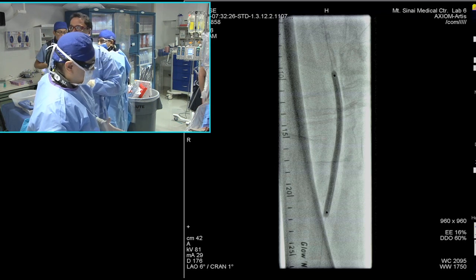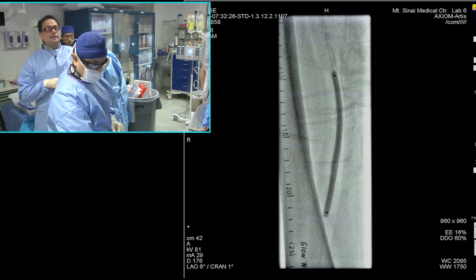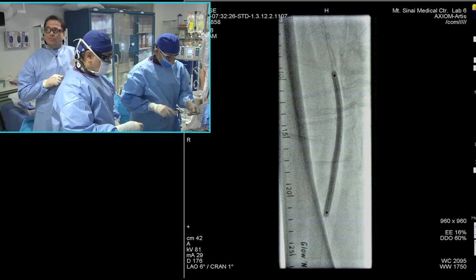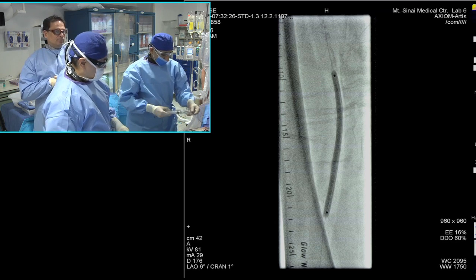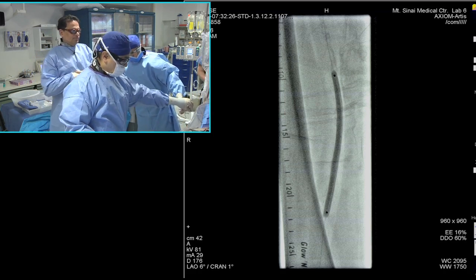We are going to end at 9. I don't want to prolong it, but what I do want to tell you is that our plan here will be to spot stent if we see a dissection. And I think we'll be able to go maybe 5 minutes over to be able to show you what we end up doing, because I think seeing the final result is very important.